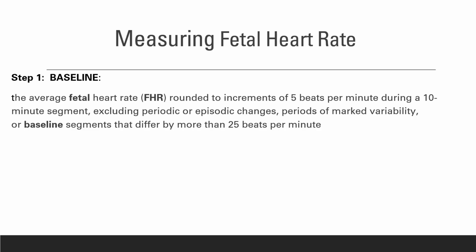Again, this terminology that you see in front of you is very, very important. Please make sure you understand what a baseline is, what variability is, what an acceleration is, and what a deceleration is as you're measuring fetal heart rate tracing.